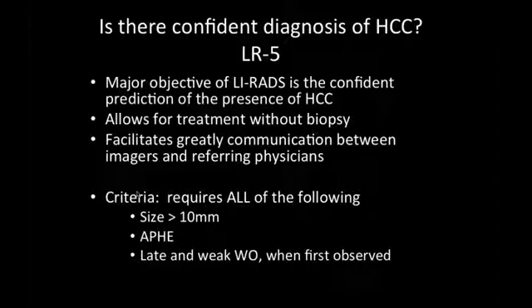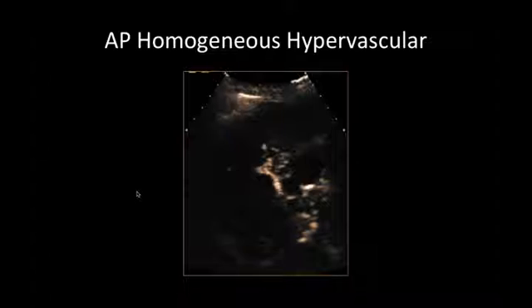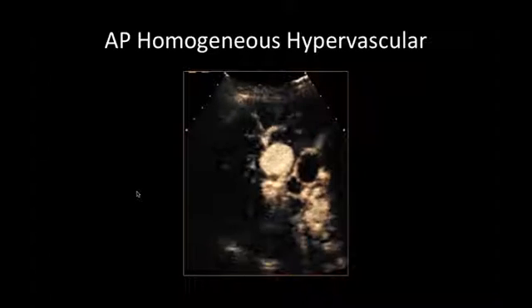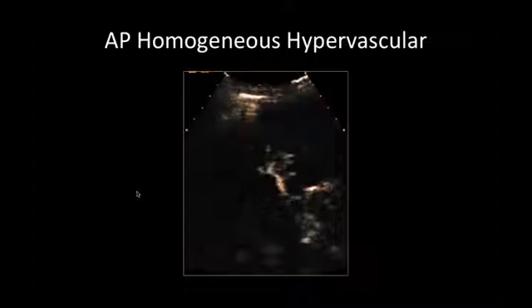So let's look at a classic example. A male with HBV, we can see a nice hypoechoic mass well visualized in the liver when we do our contrast-enhanced ultrasound. And notice again that breathing does not destroy the CEUS examination. And so this is obviously a well-seen, diffusely homogeneous and hypervascular mass in the arterial phase.